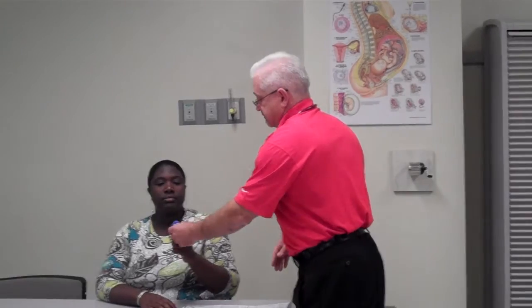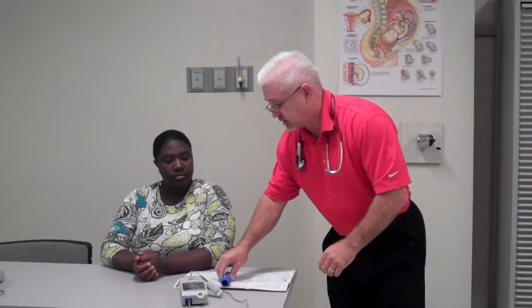Do you understand what I'm talking about? Yes, I do. Do you have any questions? No. Okay, so put it in your mouth, bite down, deep breath in, blow out hard. Okay, great. Miss Stacy went ahead and did 420. I would have the patient do this 3 times, and after I've had the patient do it 3 times, at this point I would set up my aerosol nebulizer and give Miss Stacy the breathing treatment.